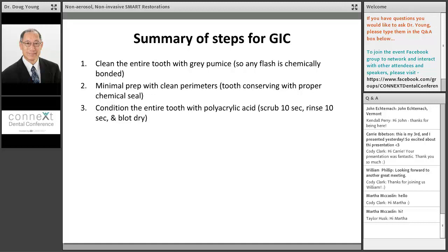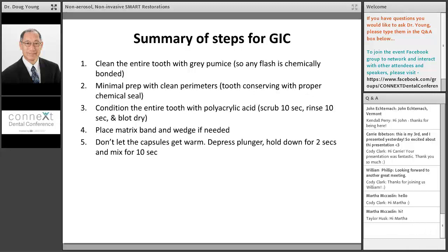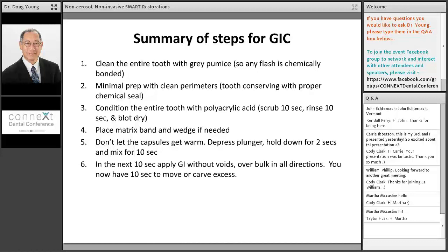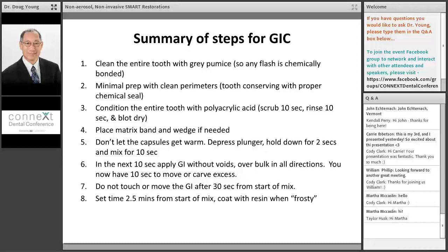Second step: partial caries removal, selective caries removal — just clean the margins, don't dig deep so you're going to hit the pulp. Number three: condition using polyacrylic acid. This is no longer an optional step in the manufacturer's instructions — it's a mandatory step. We mentioned ways to minimize aerosol by using suction devices and cotton instead of your air-water syringe. Then go ahead and place your band and wedge — I cleaned it and conditioned it before the band and wedge, because if you place the band and wedge first, now you can't clean it and you can't use a polyacrylic acid. Don't limit your working time by heating up the capsule.